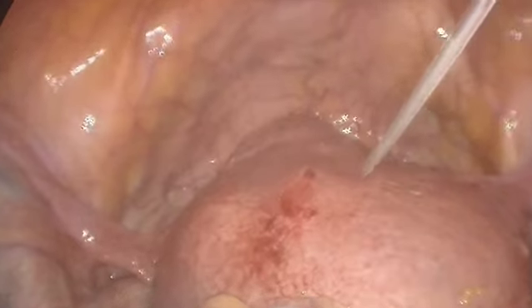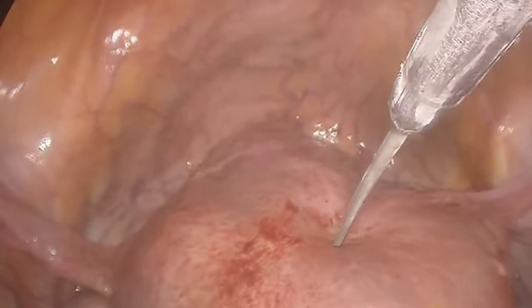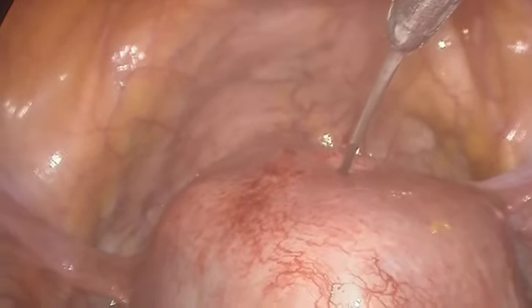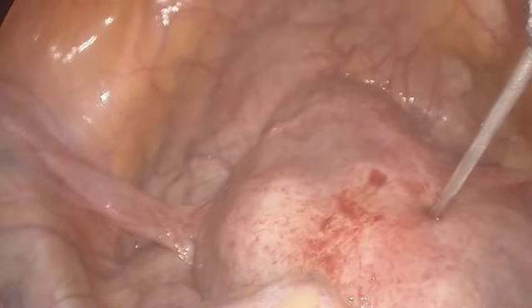Step 2. We inject diluted vasopressin into the myometrium. This helps minimize bleeding, which can otherwise be torrential in these cases. Remember, slow and controlled injection is crucial, and avoid direct intravascular spread.